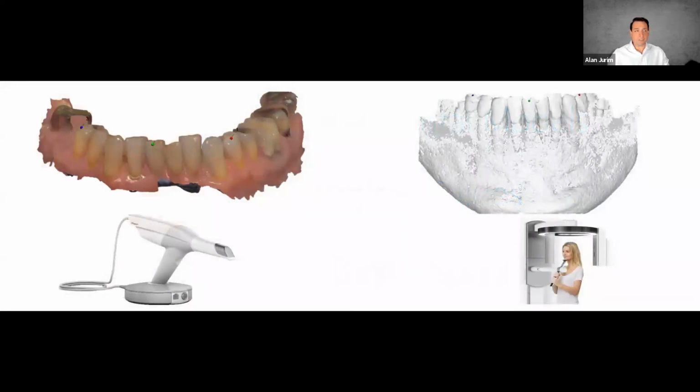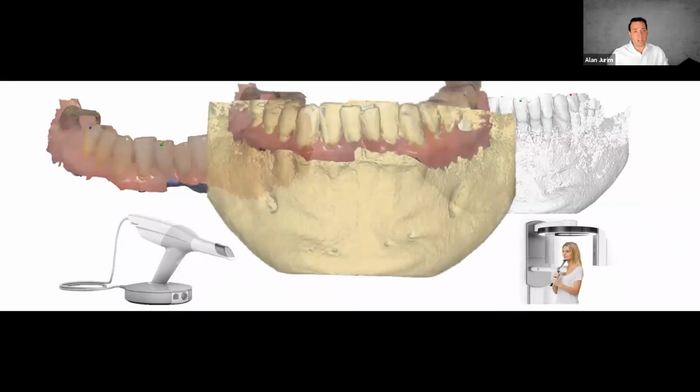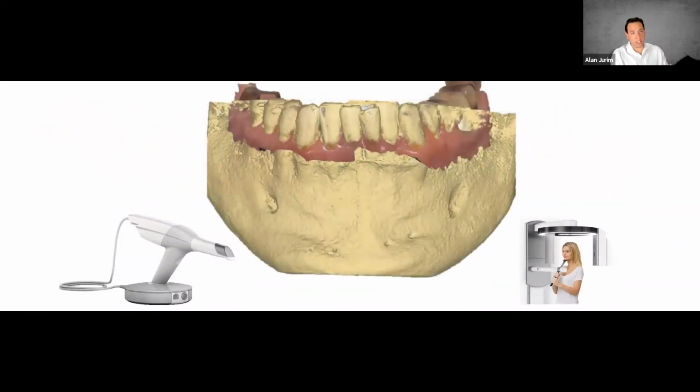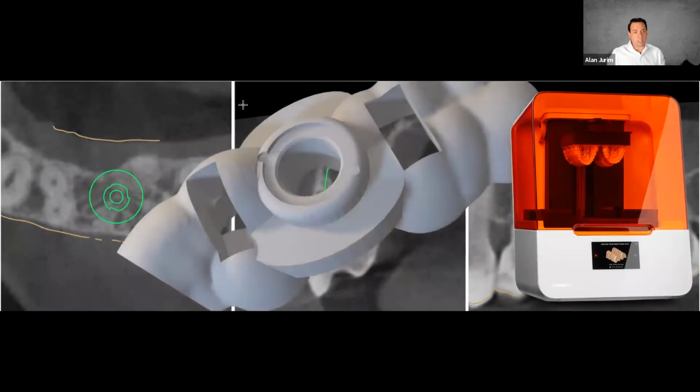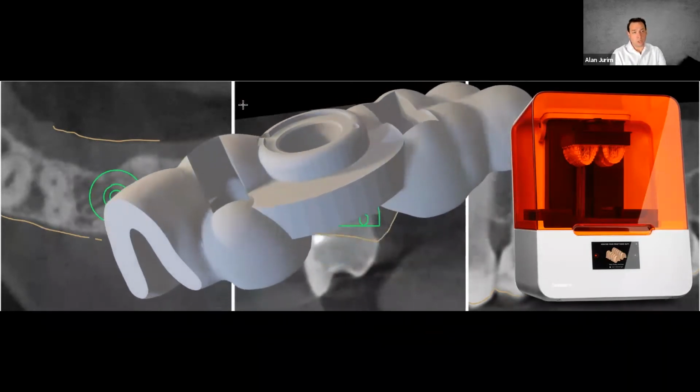And fundamentally, the process of creating a surgical guide begins with aligning these two data sets, which is a surface scan of the patient's jaw and the 3D bone information. And so a patient like this, who's going to have a single tooth implant, for a retained primary tooth, can have a plan that gets put forth, and then we can easily produce a design for a surgical guide.